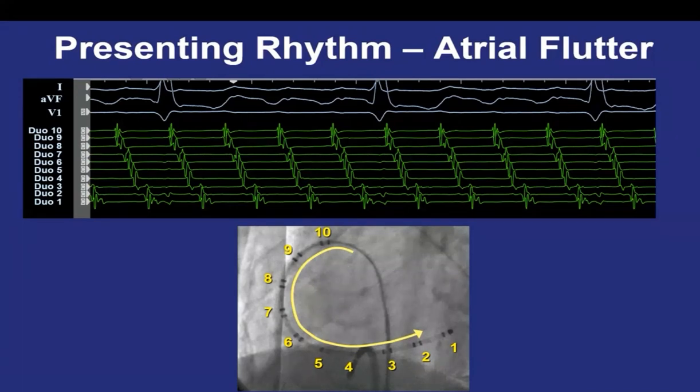So if he developed orthodromic tachycardia, then definitely he will have the early activation on the left side, at the accessory pathway, without pacing. So with spontaneous tachycardia, I'm going to assess the activation. I will see the ventricle or the atrium, whichever is earlier. All of them are applicable during pacing, without pacing, atrium or ventricle.